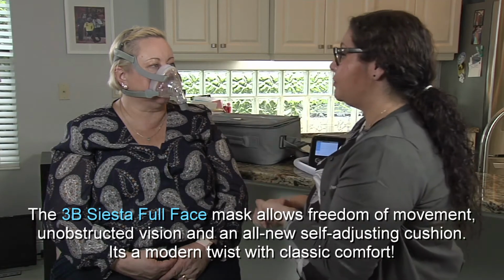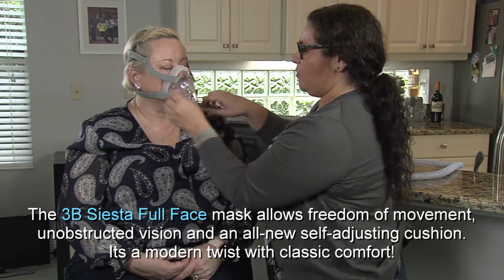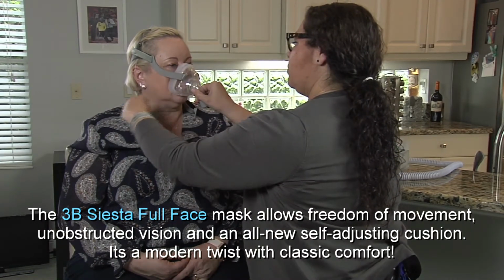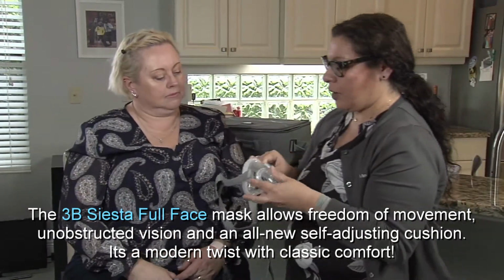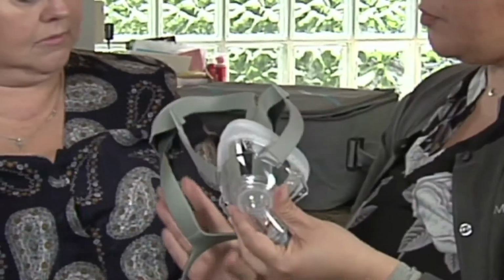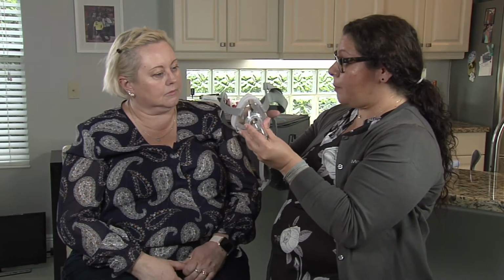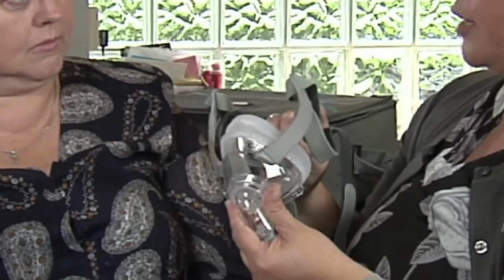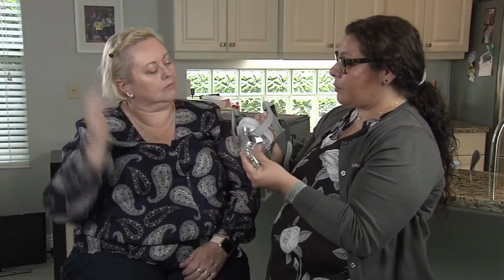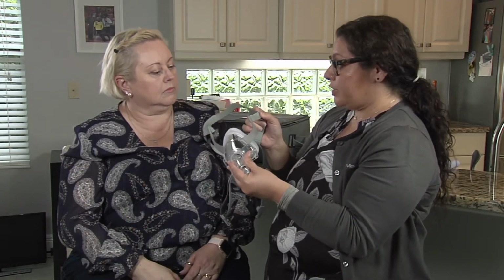I'm gonna have you try to put it on yourself. Okay. When you put the mask on, remember to grab both of your straps so nothing gets tangled. The top part of the mask is gonna go on the bridge of your nose. Place it against your face and then pull down over the back of your head. Once it's in place, you can secure the clips and then adjust your headgear as needed.